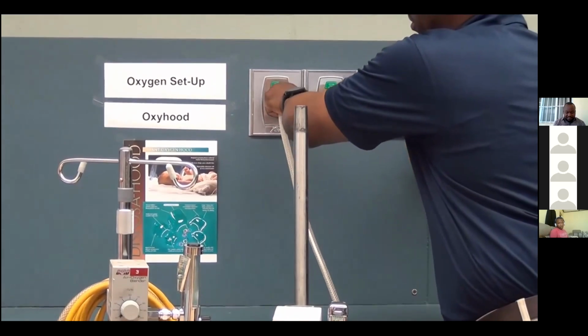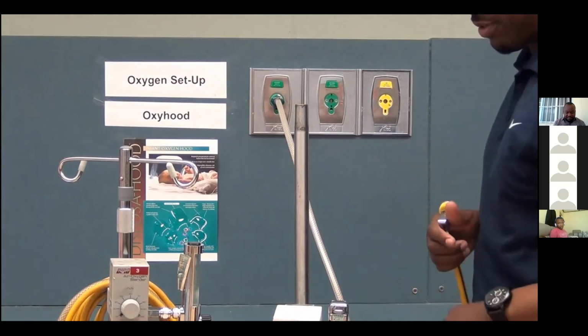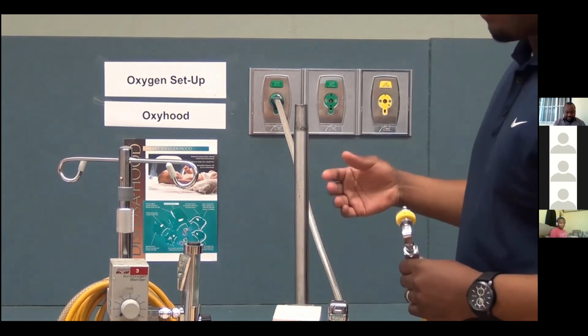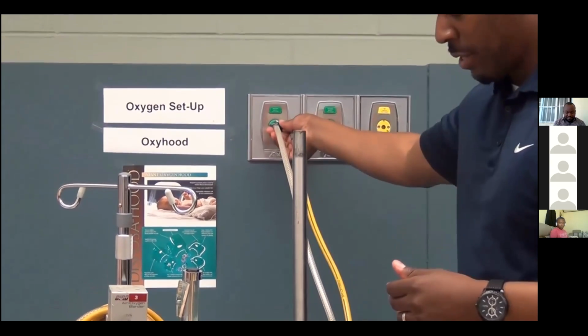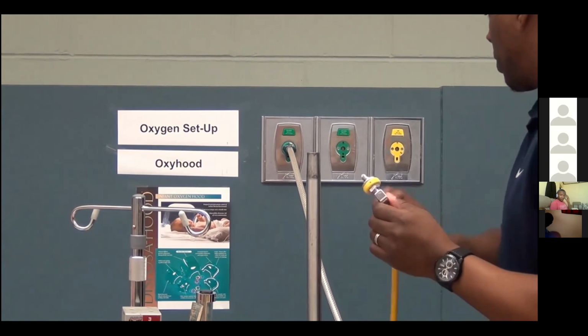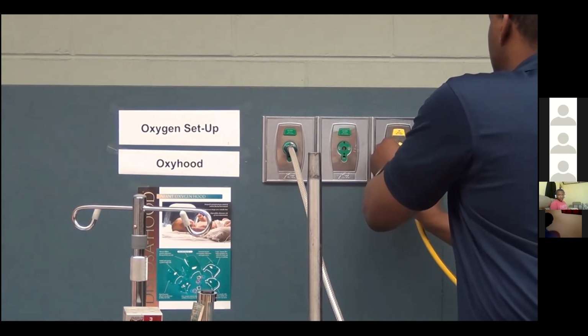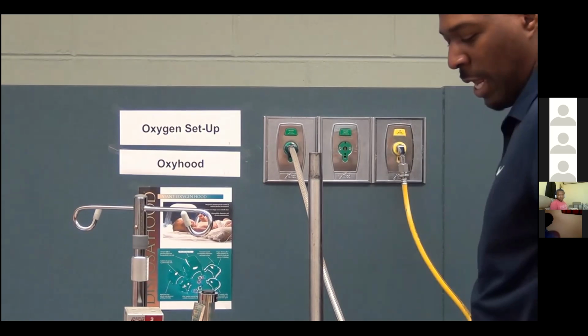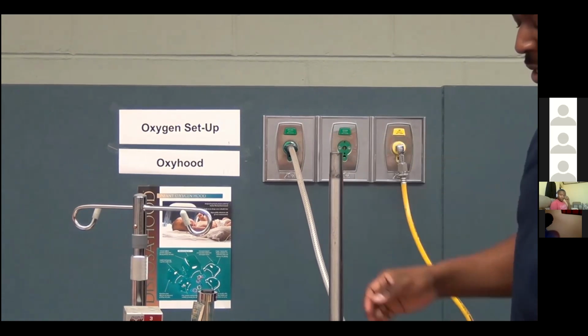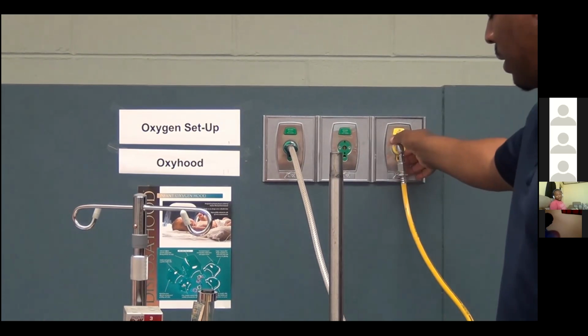So here is our loud pitch noise. If you hear this noise, that means that there's a disconnection or the tanks are empty. In order to turn this off, just plug in the other hose, like so. Once both gas sources are connected, then the blender stops its high-pitched alarm.